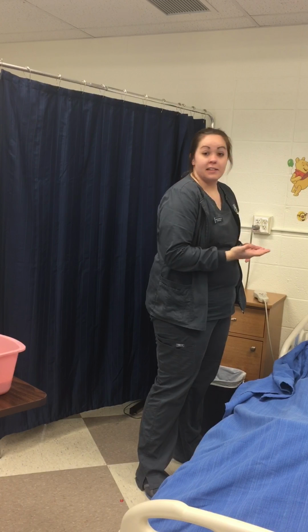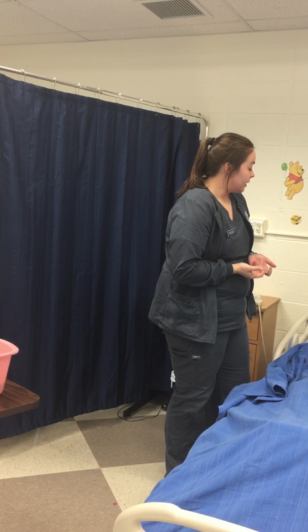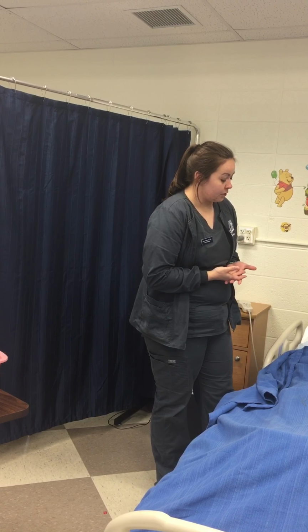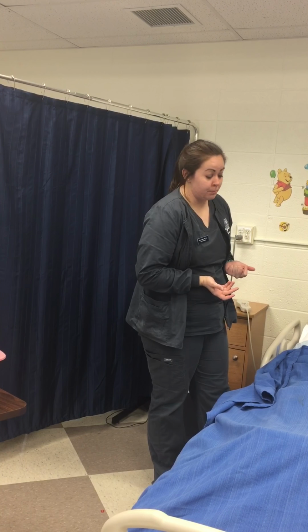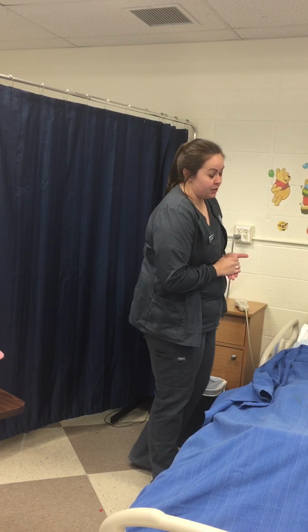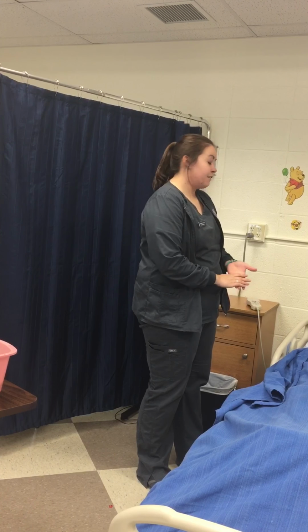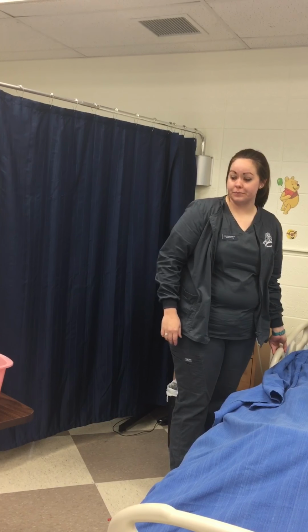and begin assessing them. So first I would assess them for their ability to understand the procedure, the characteristics of their last void, which would be the color, the amount, and the odor of their void, their ability to get into the position that is required for the procedure, and any allergies my patient might have, but especially to betadine and latex. So after that was done, I would raise my patient to a comfortable working height.